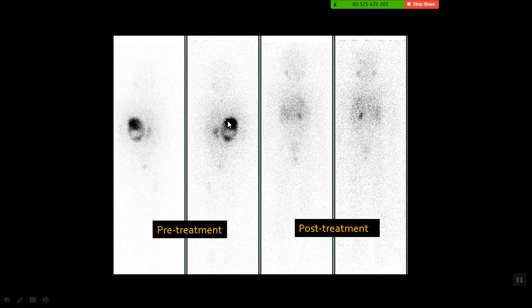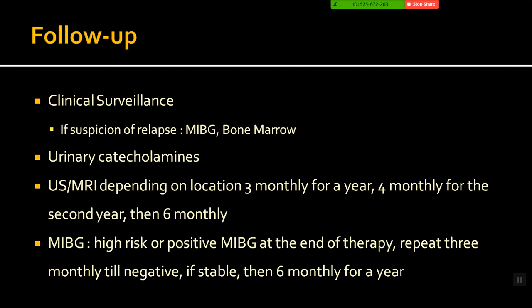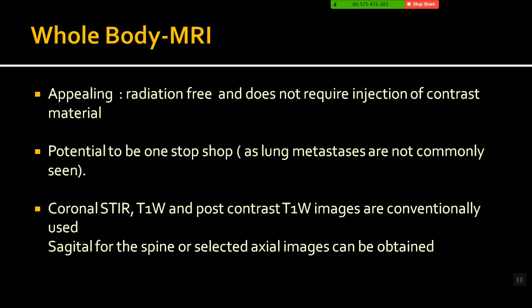And this is just a pre and post treatment scan to show you this MIBG concentrating neuroblastoma has completely responded on post treatment. So this is like a CR. For follow-up imaging, yes, very often, as you can imagine, neuroblastomas are invading the normal tissue. So it is not possible to have an R0 resection like in the rest of the body. So the word we use is GTR, where we can remove more than 95% of the tumor. And very often when these patients come for follow-up, there will be some residual disease in them. So we use follow-up imaging to see if it has remained stable, or it is involuting, or it is progressing. So imaging is also used for follow-up.